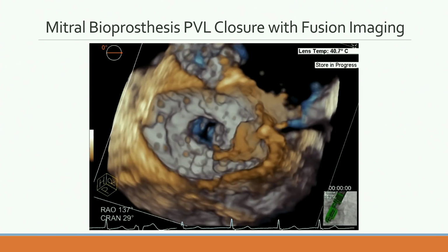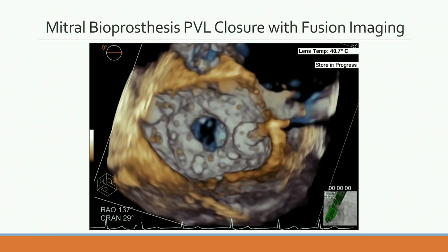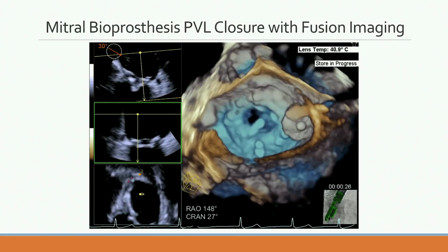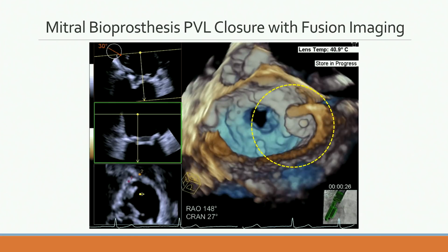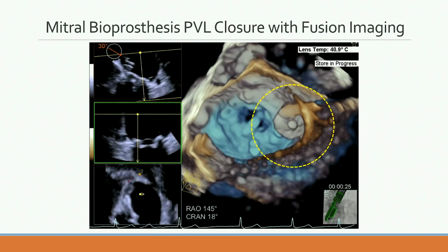Now again, this is a 3D transesophageal echocardiographic image in the surgical view, and you see that now a plug is being opened. The left atrial disc is opened, closing the paravalvular leak. In the next image, we can release the device, and we will check also with the color Doppler and other imaging modality whether there's satisfactory position or not. Now you can see the nicely placed device. It's stable and closing the paravalvular leak roughly at 5 o'clock on this surgical view of the mitral prosthesis. And that's the highlight, the location of the AVP2 at the side of the mitral bioprosthesis.